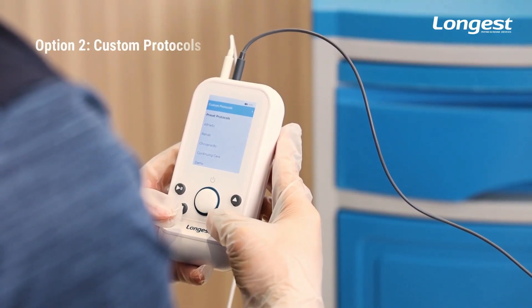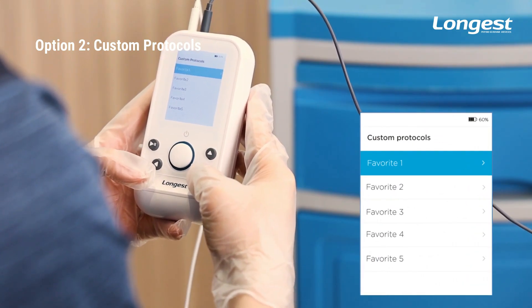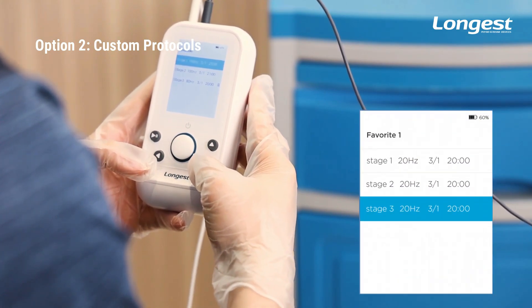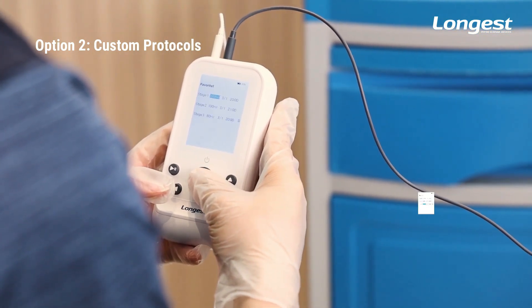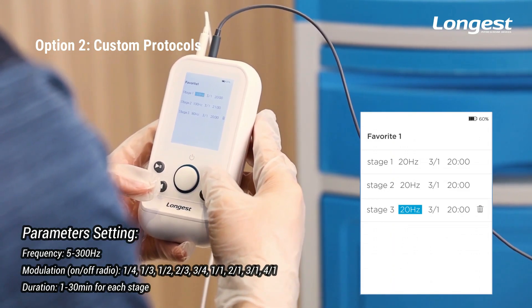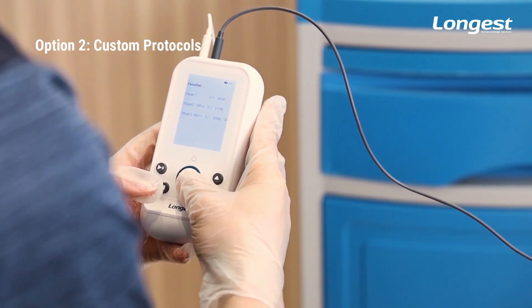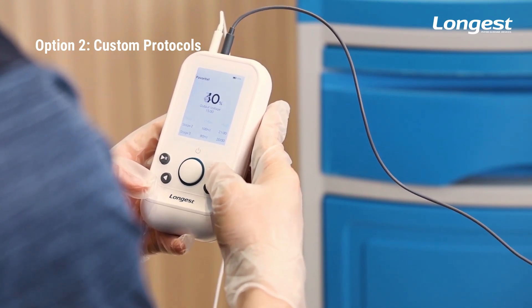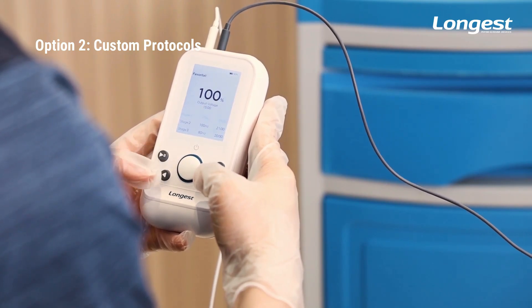You can also personalize the protocol for the patient by selecting custom protocols. You can customize and save up to five custom protocols. By default, each favorite is a three-stage treatment. Compared with preset protocols, which can only adjust treatment duration, in custom protocols you can adjust frequency, modulation, and treatment duration for each stage. After finishing the parameter adjustments, press the Start button to enter the treatment management interface. You can adjust the output voltage by pressing the Up or Down button, then press Start to begin the treatment.